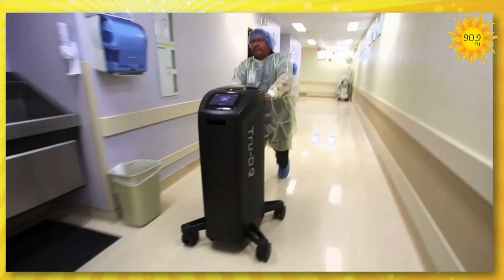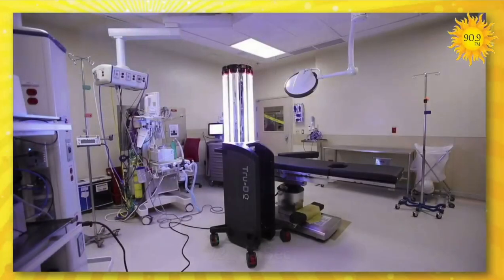Got you. But the robot is using that ultraviolet light to kill these things, I guess those in contact with those beams of light. Is that kind of the idea? Right. It is. It goes into the room and it kills everything in the room. It's 99.9% effective, and like I said, that's what it does. It's after the housekeeper. So if a patient is admitted that has either C.